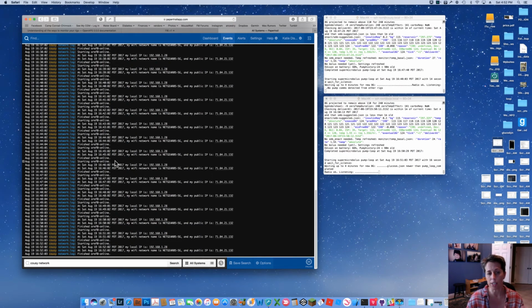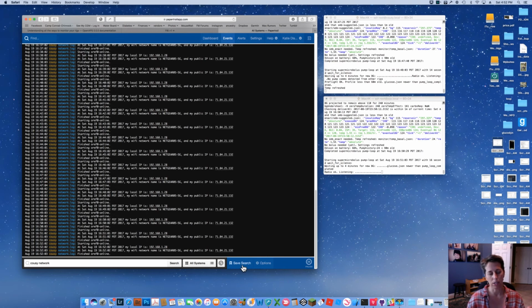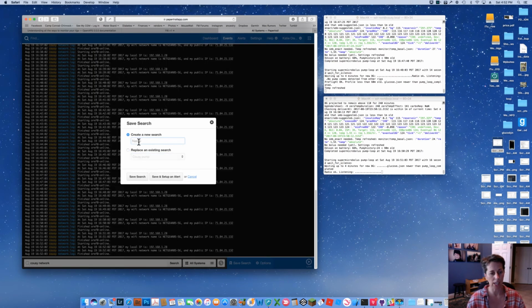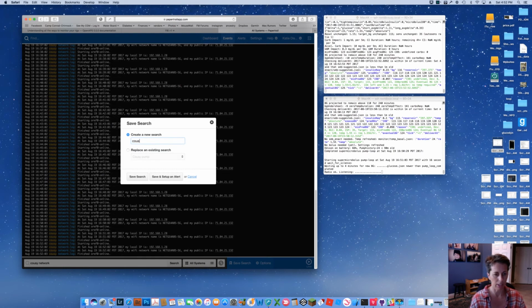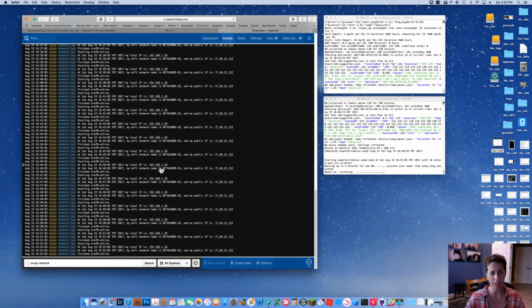Online cron is running, and every minute or so it's checking my Wi-Fi connection, my IP address is on here. This is another useful search to save. So I'm going to create a new search. I'm going to call it cousy network or cousy Wi-Fi or whatever you want to call it. I'm going to save it.